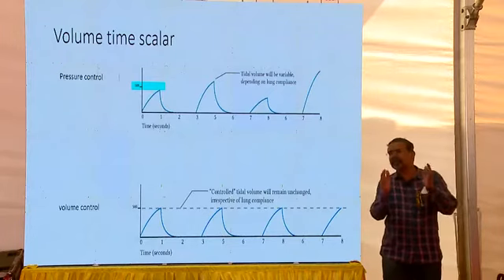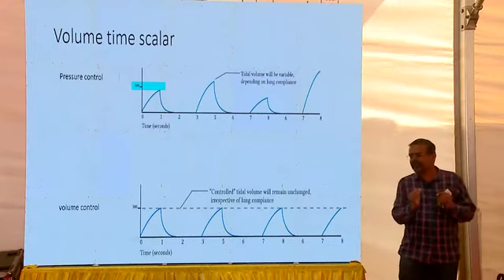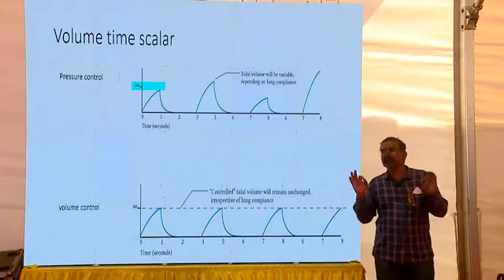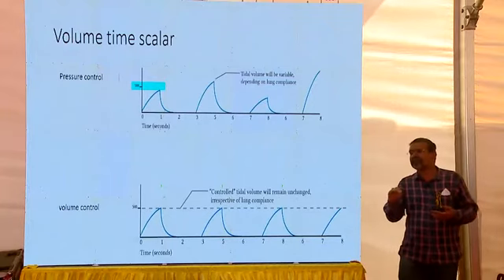So as far as pressure and volume are concerned, they are different. The typical baby for volume is a young extreme preterm baby with a vulnerable brain, who has improving lungs, maybe abnormal brain, and where CO2 control is important. X-rays are relatively good. They have tachypnea more than distress.